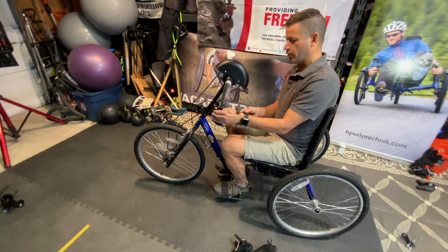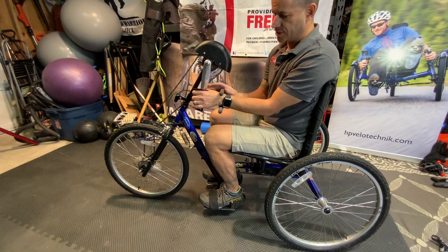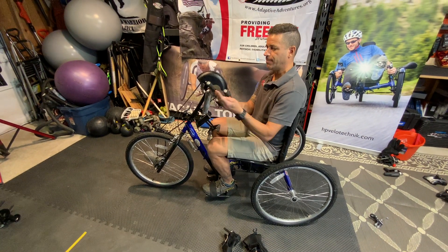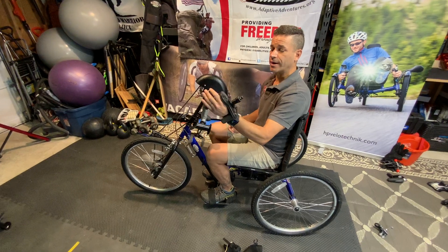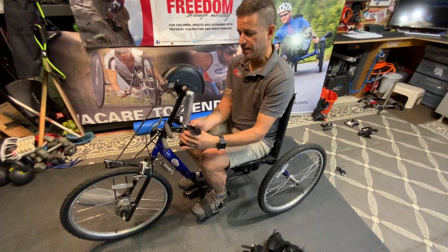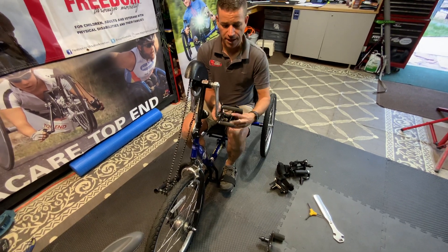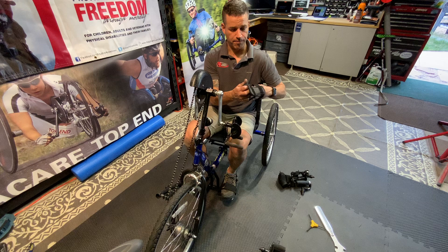The first one is this quad grip, which allows a tri-pin system, which is also similar to this system. A tri-pin allows a person to grip — if they only have light grip or modified grip, this allows them to utilize the crank arm function. Some of these have quick releases, so they go in and out easily to accommodate somebody without that ability for grip and power.